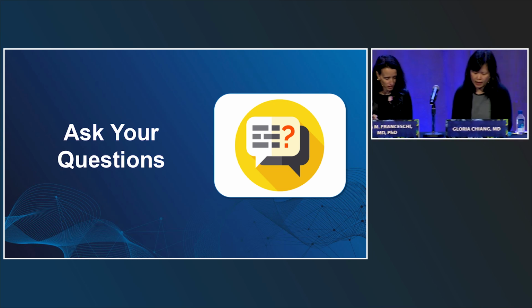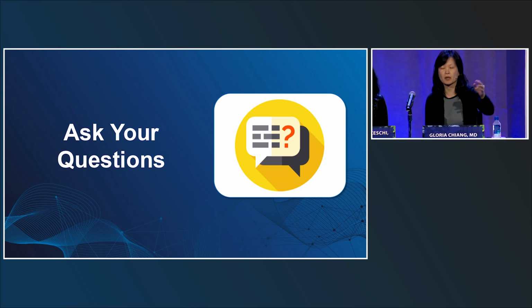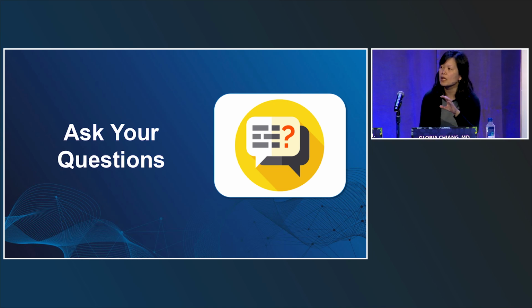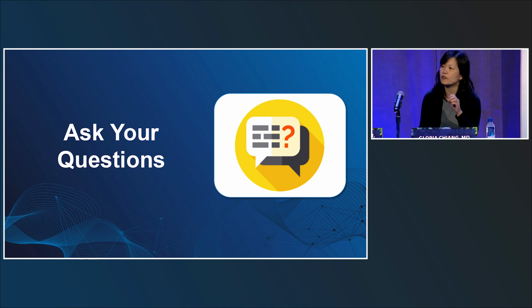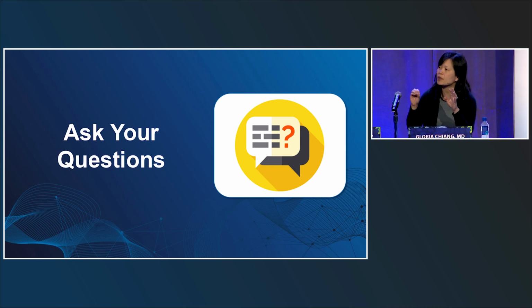Yeah, and also related to that, how do you deal with visual and quantitative mismatches? Like visually looks normal, but then there's an area of abnormality. So that's something my postdoc Mohammed and I are publishing a paper on right now, it's actually accepted in AJNR, that did precisely that. So there's actually very high concordance between visual assessment and quantification with centiloids. It was 97% with florbetaben. But exactly, it wasn't 100% because there were cases where visually there was a focal area of amyloid that wasn't picked up by centiloids. And for those, I tell my neurologists, there's a focal area, usually in the temporal lobe, that's something we need to follow. And then you sort of have to put the picture together, often with tau PET, FDG PET, to decide whether or not to treat that patient.